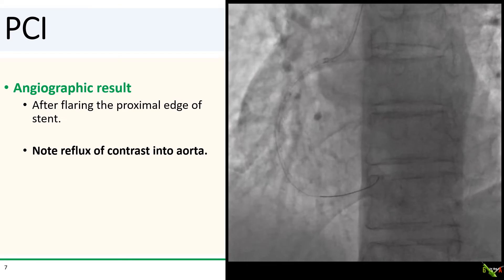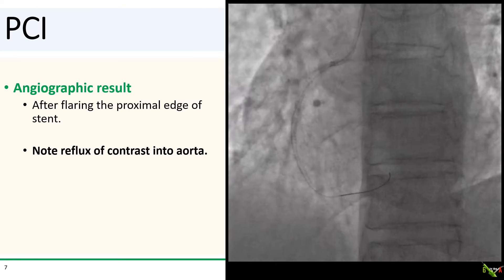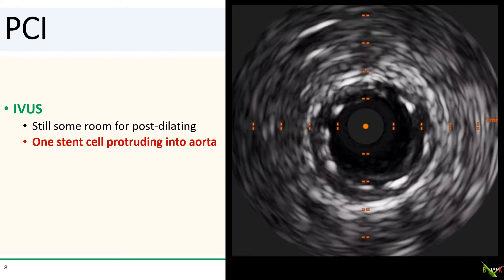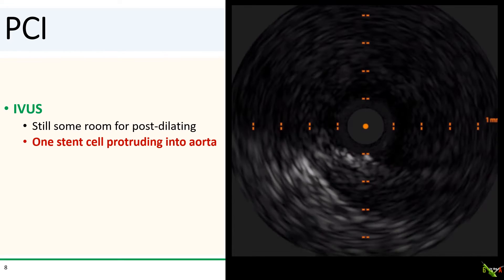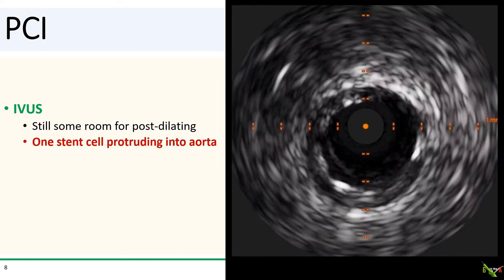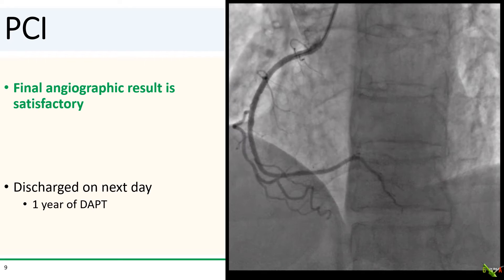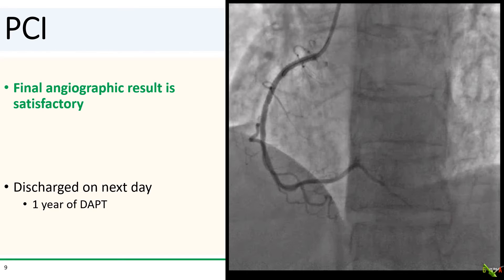Here we are after stenting and flaring the proximal edge of the stent. There is no residual dissection, and notice that we now have normal reflux of contrast into the aorta again. We did IVUS — there is actually quite a bit of plaque there, and still some room for post-dilating. The ostium is fully covered, and there is only one stent cell protruding into the aorta. Here is the final angiographic result after more post-dilating, and it looks quite satisfactory. The patient did well and went home the next day.